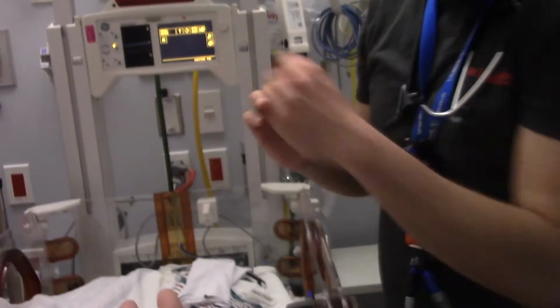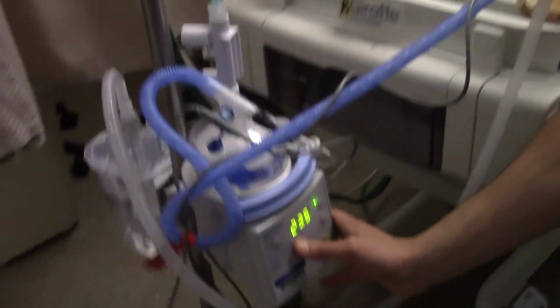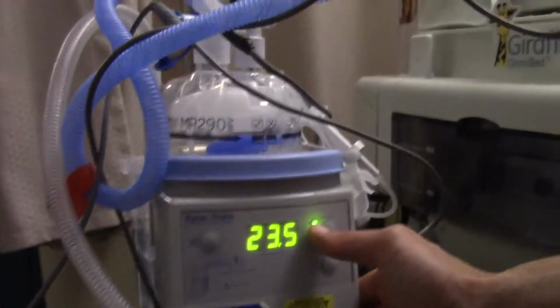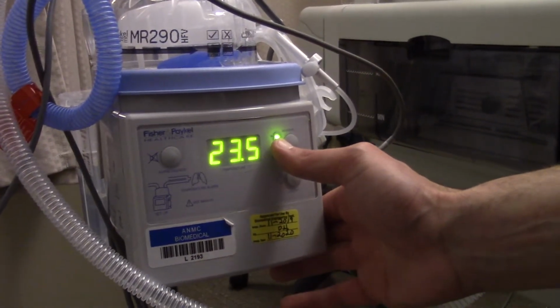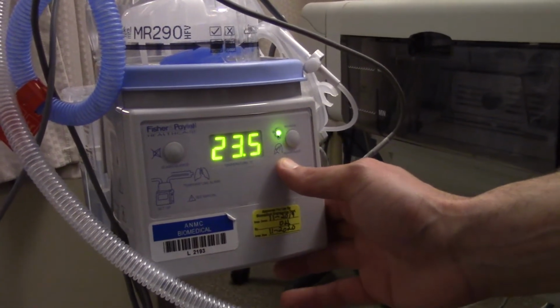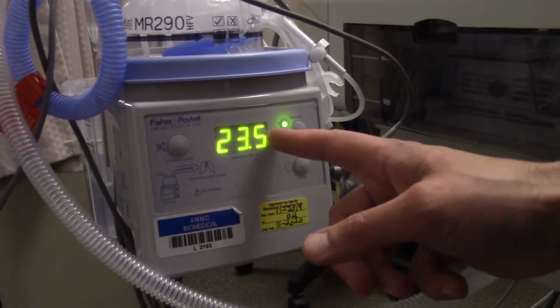And I'm going to plug it in so that you guys can see the different levels. Invasive on top, non-invasive on bottom. The invasive will heat up to 37, non-invasive to 31. Typically we want to run in the NICU at 37.